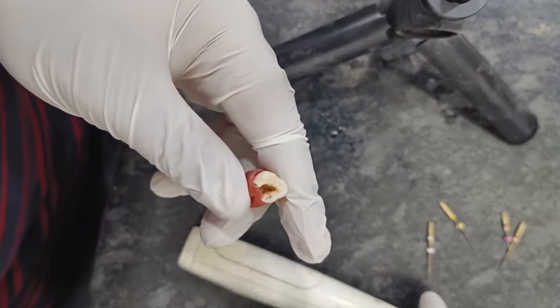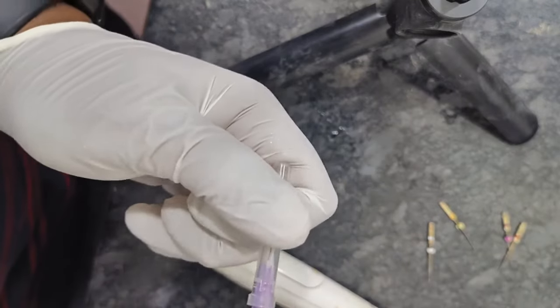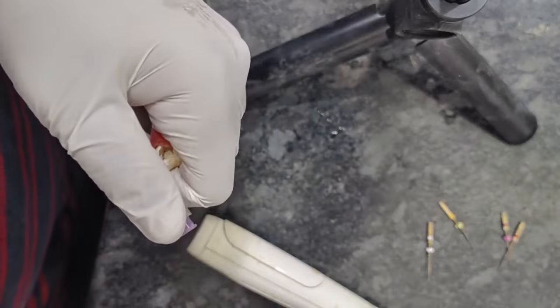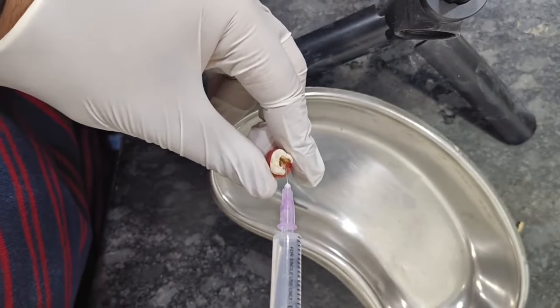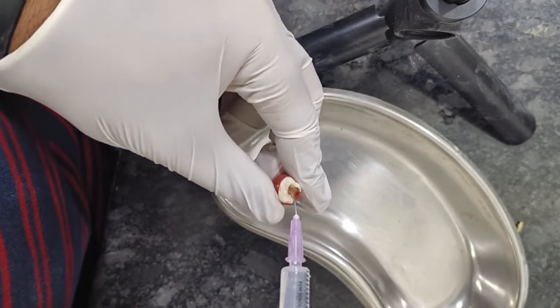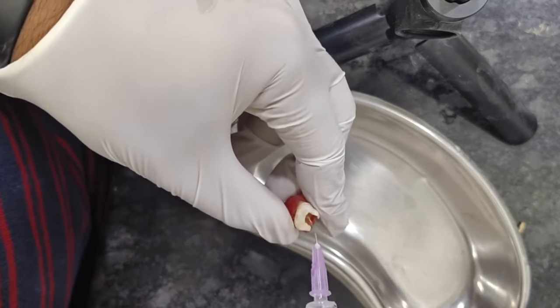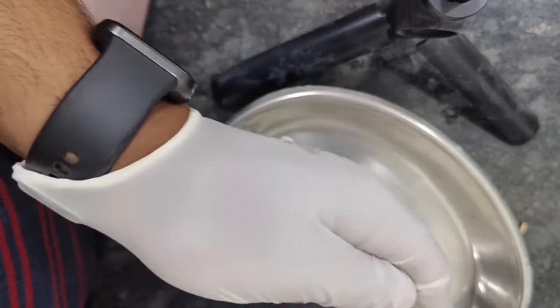So after this, again we are going to irrigate with sodium hypochlorite solution. We should do copious irrigation with sodium hypochlorite. Here I am using plain saline, but you have to use sodium hypochlorite solution. In each and every canal I am using sodium hypochlorite. You have to use a full syringe, 2.5 ml of sodium hypochlorite, inside the canal.